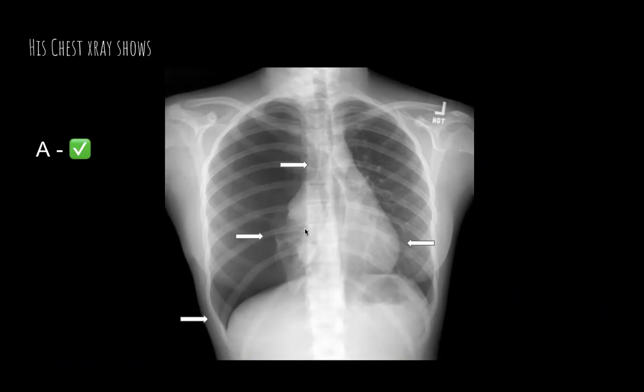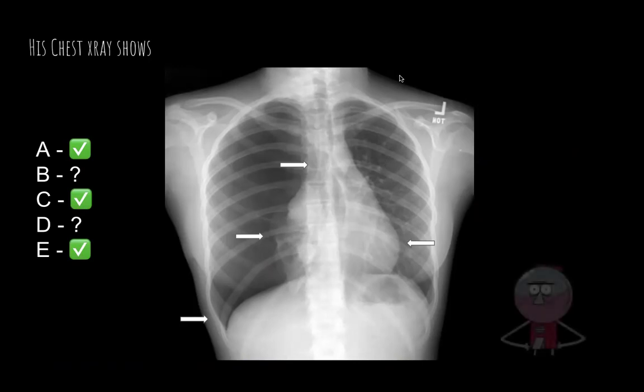So let's recap. For our airway, it looks okay, but with breathing, it looks like there's something strange going on on the right side. Our circulation, we said looked good, but we did notice a little bit of an abnormality on the right side of the diaphragm. Everything else, it seemed like there were no foreign bodies and the bones had no obvious fractures to us. So let's see what's going on.